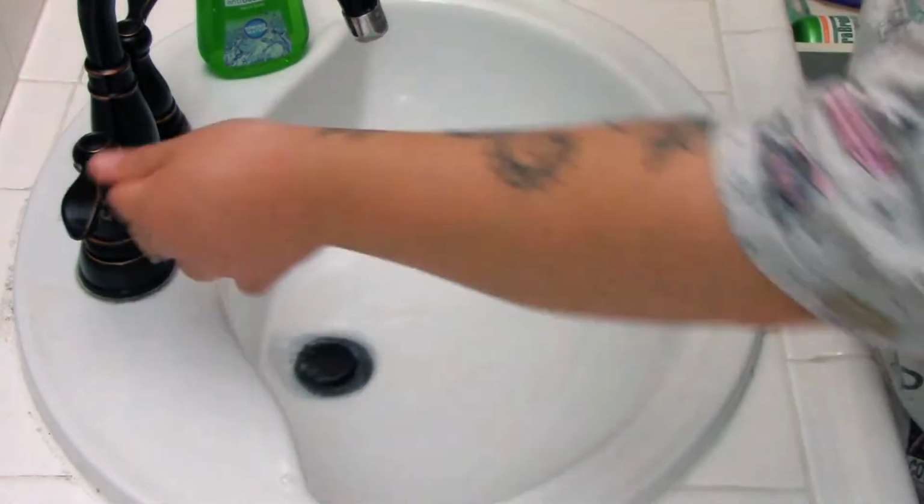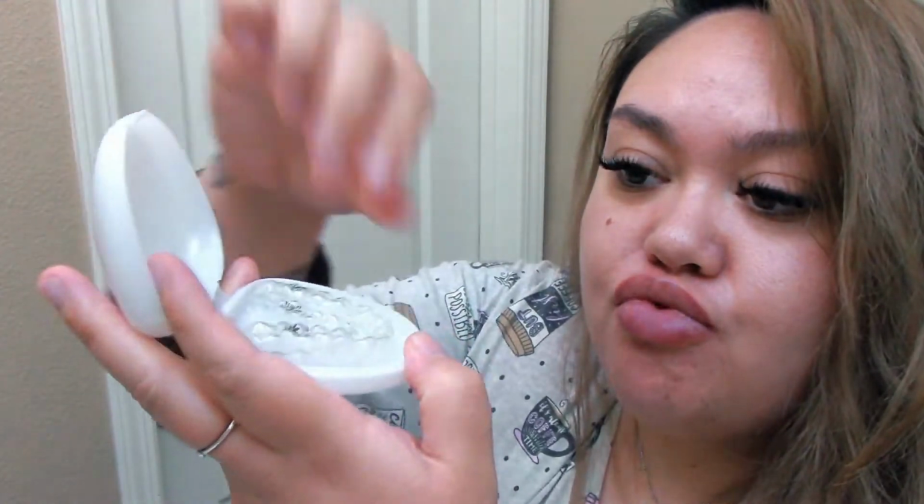Sometimes I skip breakfast, so I'll just go straight into flossing. But this is the routine I do after eating every meal and before putting in my trays. You want to make sure your teeth are nice and clean before you put your Invisalign trays back in. Then I go ahead and get the Invisalign trays and put them back in and go on about my day.